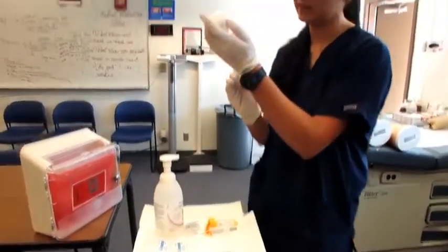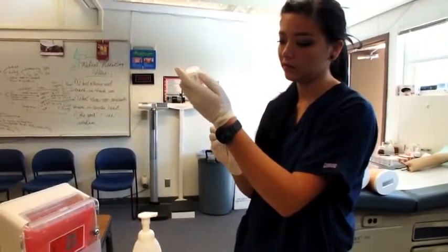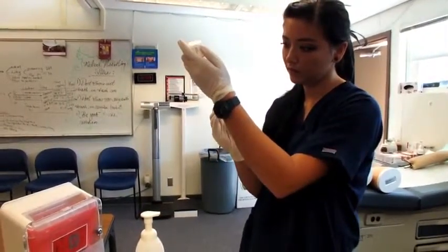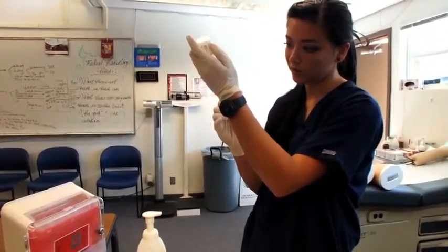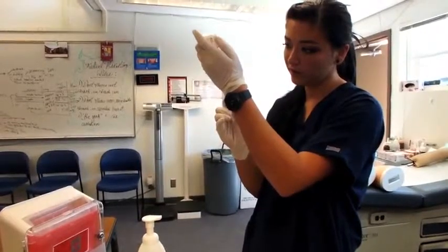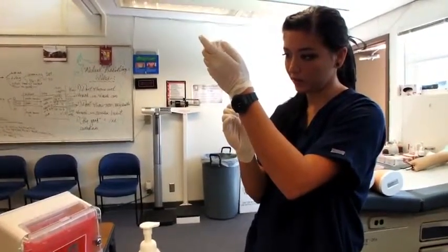I'm going to be doing half a cc or milliliter. Let's make sure there are no bubbles in the medication at all.